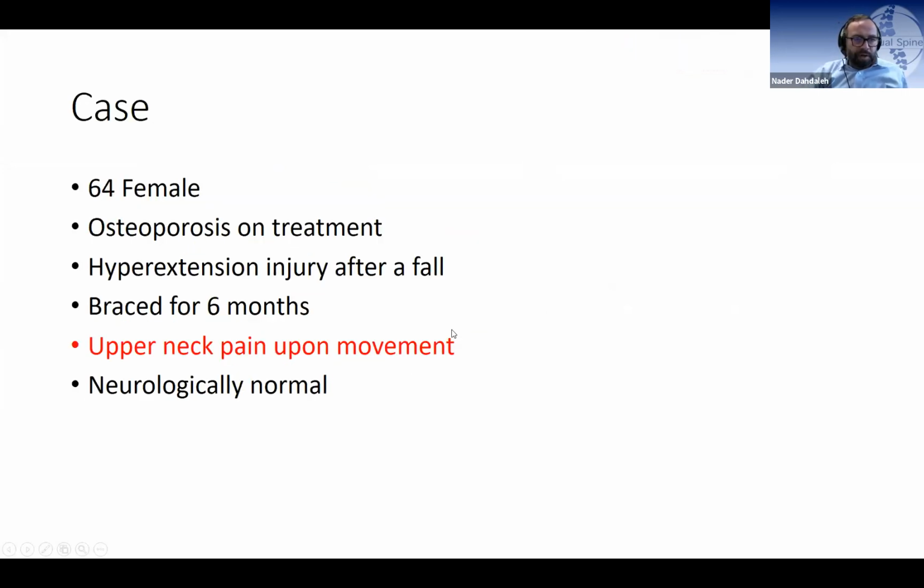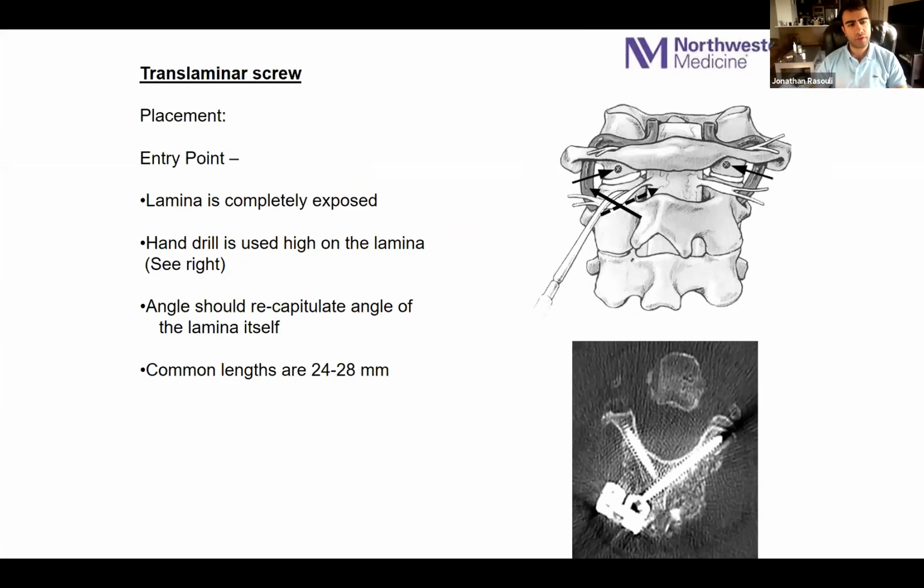So I'm going to show it. Do you always preserve the C2 ganglion, or do you ever take it? Because actually, there's a very nice paper that Ali wrote, looking at the anatomy of the C2 ganglion and whether or not it affects patient outcomes by sacrificing it. I think the conclusion in your paper, Ali, was that it didn't really affect patient outcomes very much, if I'm not mistaken. But I'm just curious what your protocol is.